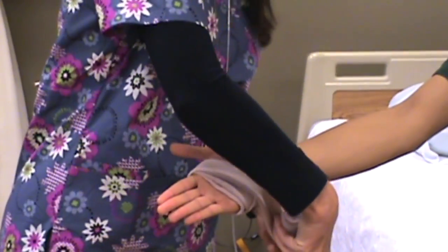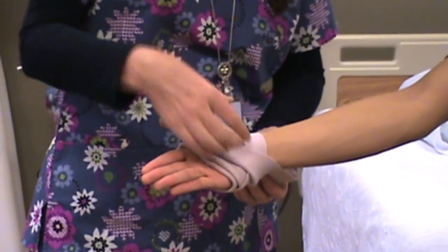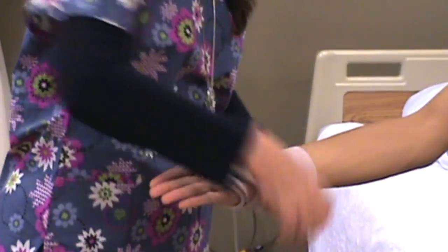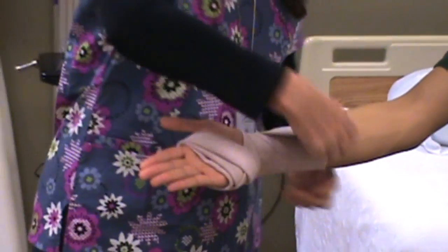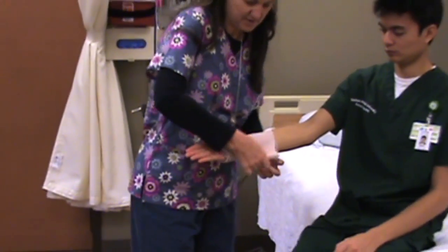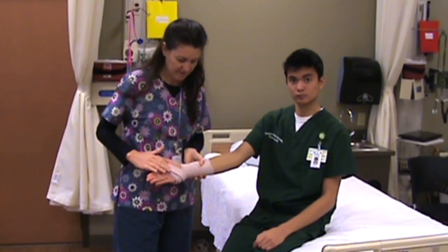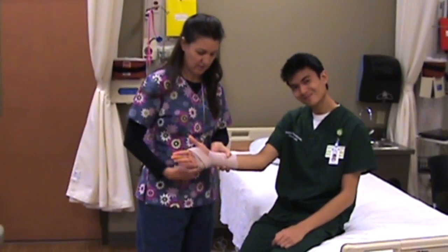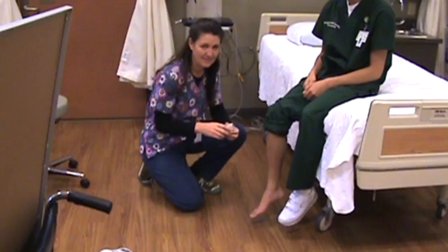And then depending on where your problem is, you can keep going up and down like a figure 8, or if your problem is down more here, you can open it up and continue with your reverse spiral, which is what we're going to do for this patient here. And then that just gives a little more stabilization here, and then you can put your tape here. And that's what your figure 8 looks like for your hand. You want to leave your fingers out and your thumb out.